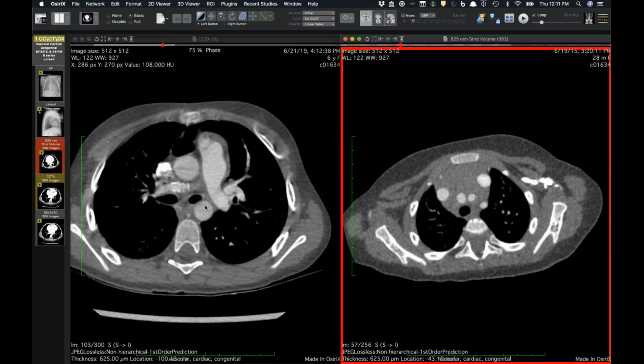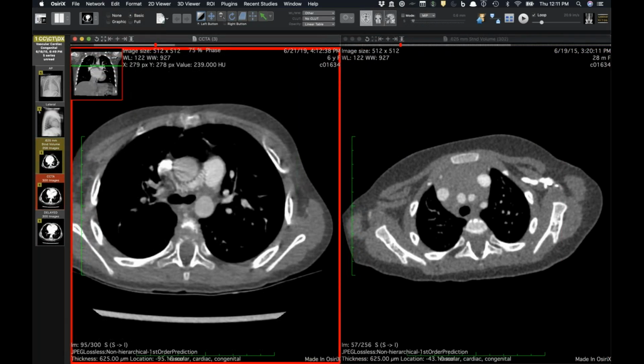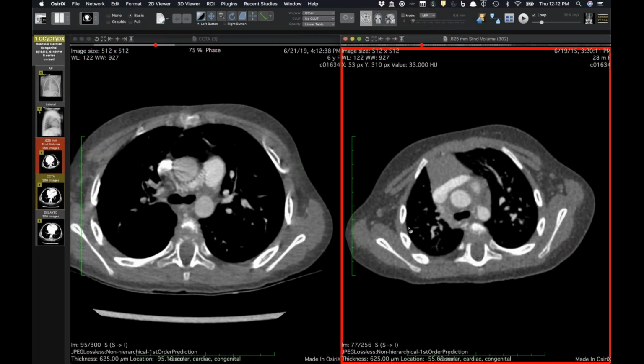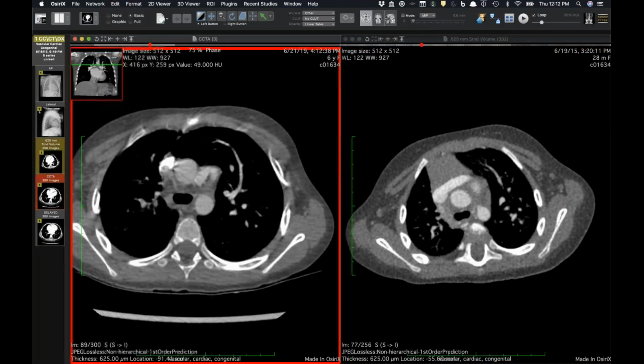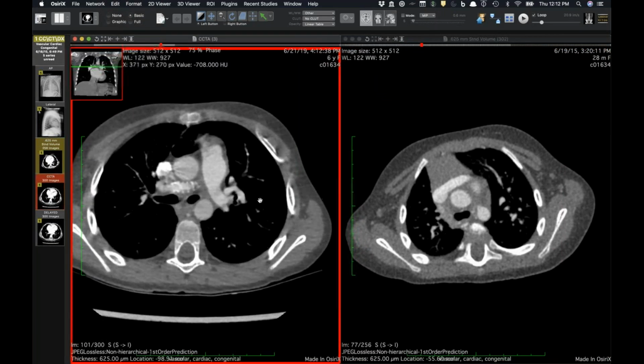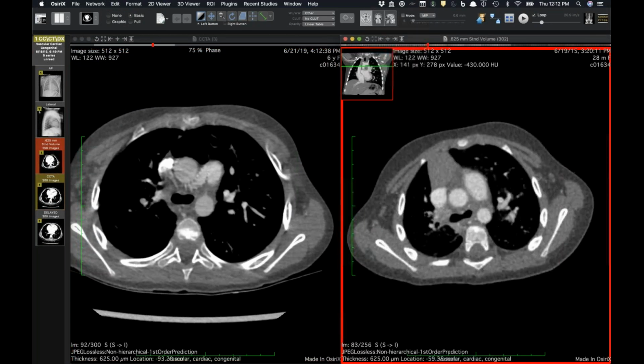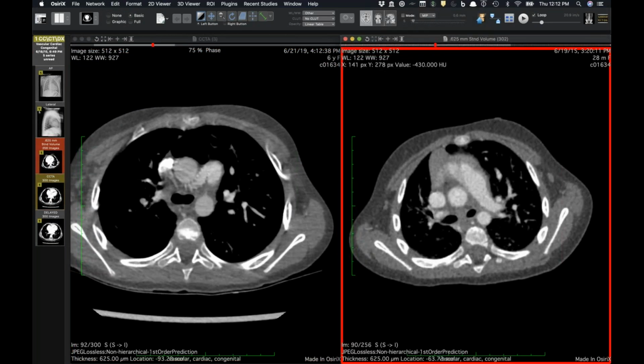Yeah, no, the second case, I called that an isolated PA with ductal origin. Yep. That's a term that I use for those. I mean, it's super rare. It's only the second one I've seen. Yeah, no, it's a very interesting case that he had bilateral patent ductus. Yeah. So why isolated as opposed to proximal interruption, right?